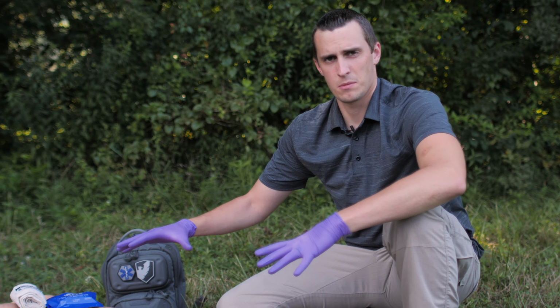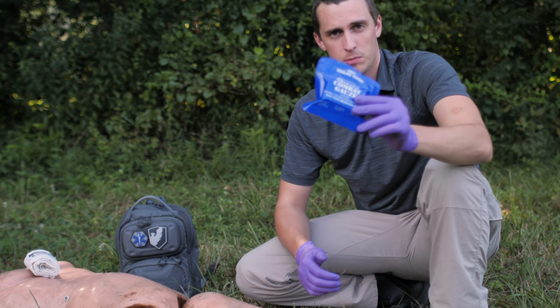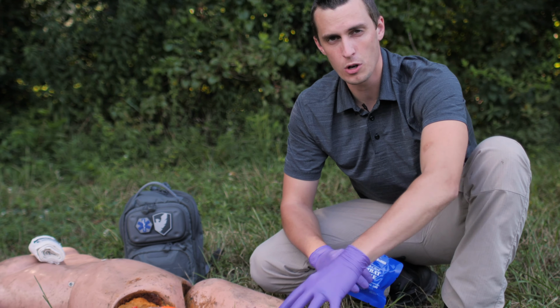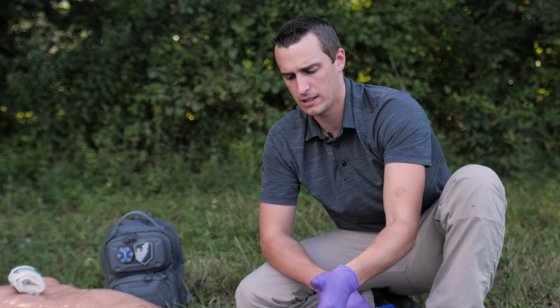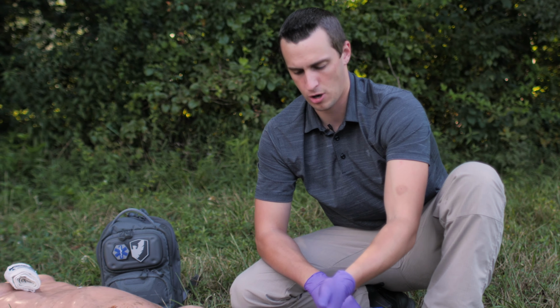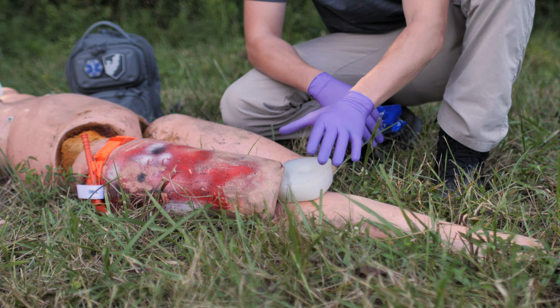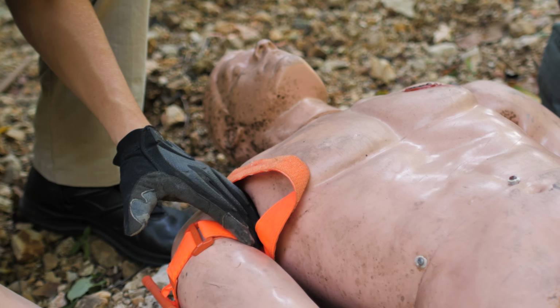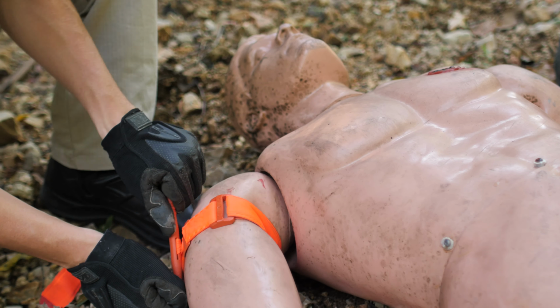Okay, now that we're talking about our tourniquet conversion, we're working on converting this over. We're going to pack it with some QuikClot and we're converting it over to wound packing rather than the tourniquet. So we are simulating that we have an isolated gunshot wound or penetrating trauma just below the knee. We've had severe arterial bleeding, and we have applied a tourniquet high and tight in the danger zone. We've gotten him out of the danger zone, and now we're running through the MARCH algorithm.